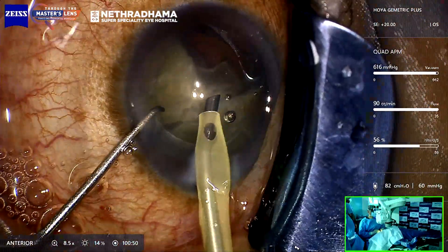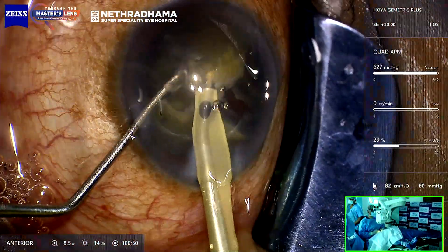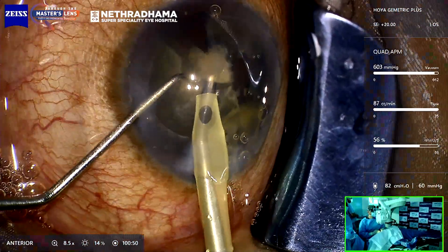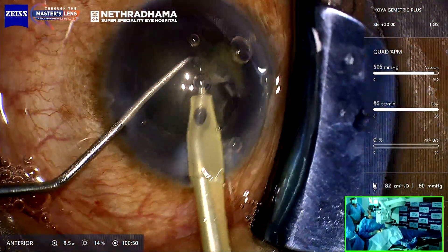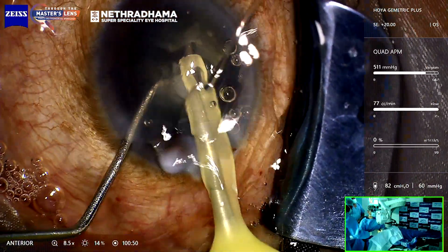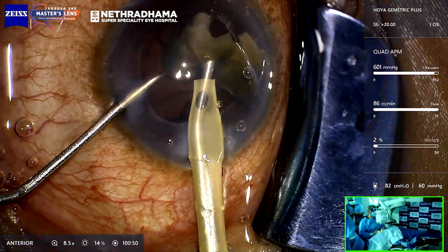You can see that the followability is excellent and chamber stability is excellent. I've removed one quadrant; this is the second quadrant. You'll have to separate the piece fully — if it's attached it will not come up to the center. Then you can chop it into smaller pieces. APM stands for Advanced Pulse Modulation — it's a pulse modulation to improve followability and efficiency. You can see the last piece; I don't actually reduce the vacuum.